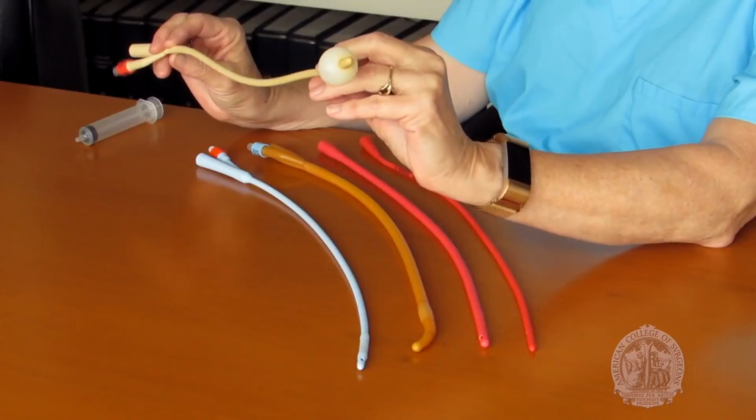I've talked about both indwelling and non-indwelling catheters, so it's probably a good time to talk about that a little more. Indwelling catheters, such as this one, are placed under sterile conditions and have a balloon at the end to ensure that they stay inside the bladder. They're used when the patient will need catheterization for several days. The most common type of indwelling catheter is a Foley catheter like this one.